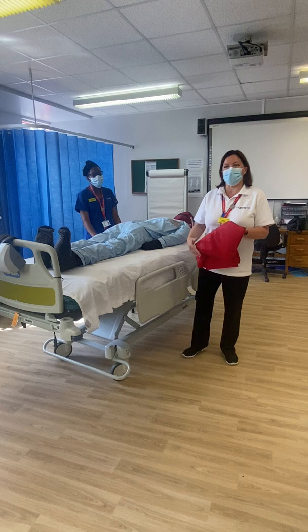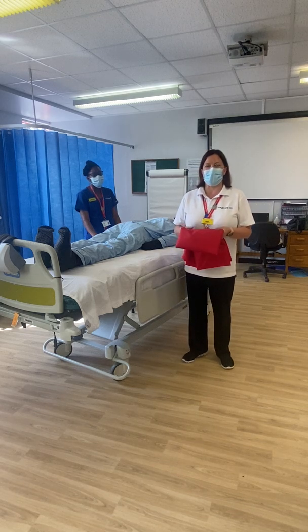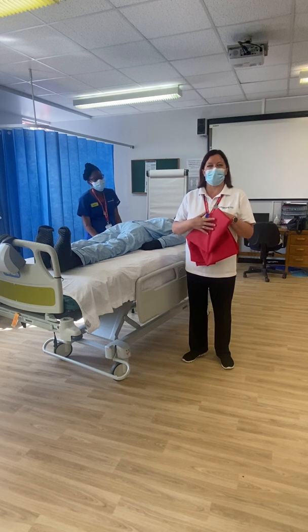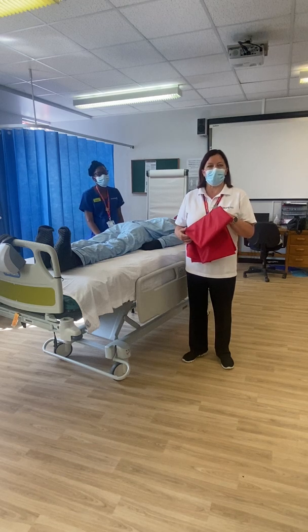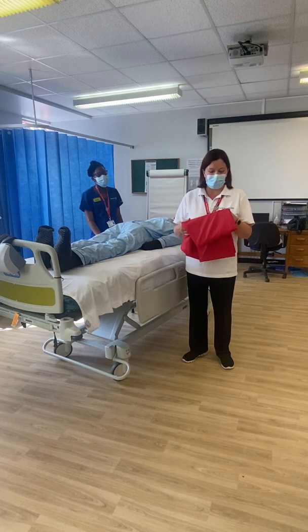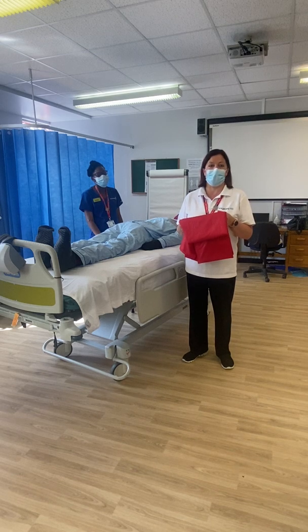Slide sheets we use in order to effect an easy move around a bed or another surface, whether up and down or laterally. The reasons that we use this is that these are very low friction, which means it's ease of use. So it makes life easier for the staff to start to move patients around the bed, and also it helps to prevent some pressure damage from moving the patients around the bed. These slide sheets are single patient use, and that means that we can use this multiple times for the same patient, but only for that one patient.